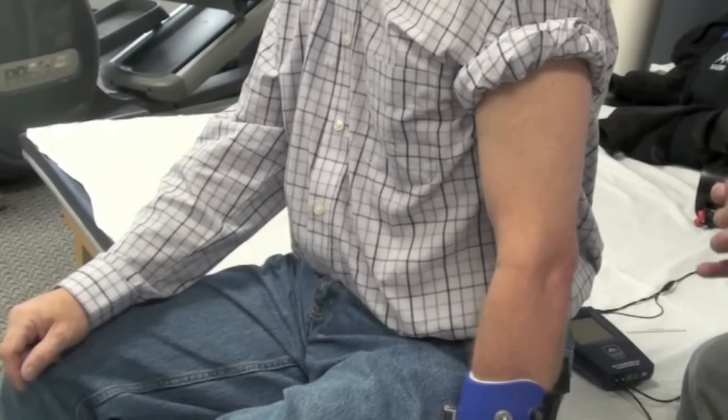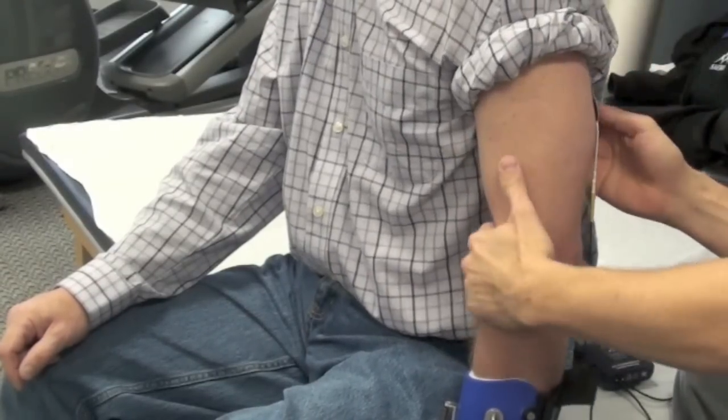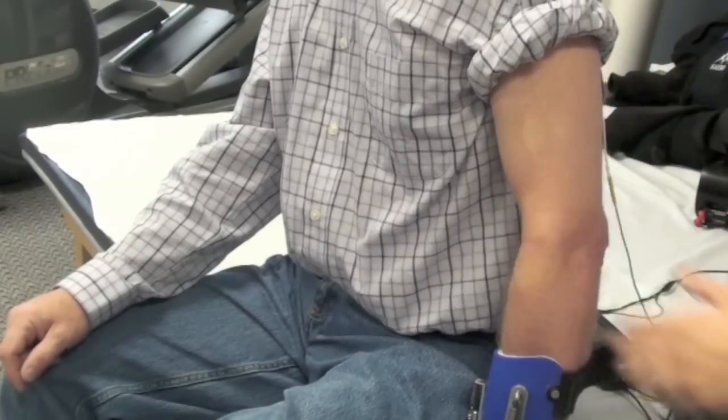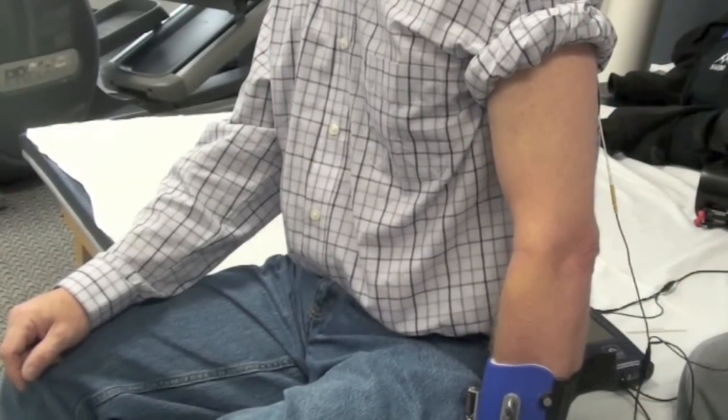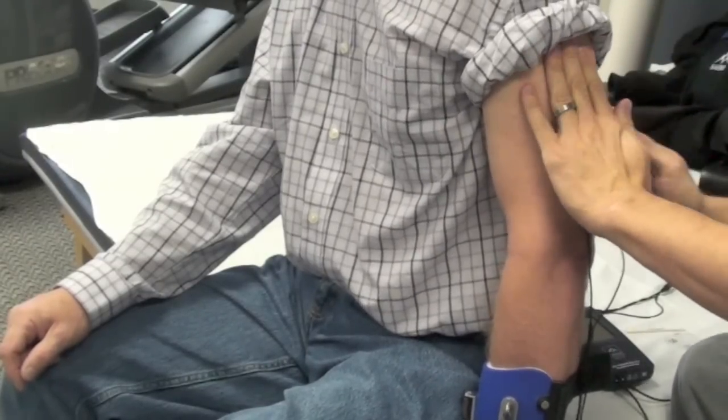To begin, you will apply two stimulation electrodes to the tricep muscles. As a reminder, with the RETS program, channel A will be for the stimulation, which is two electrodes, and channel B will be for biofeedback, which will consist of three EMG electrodes.